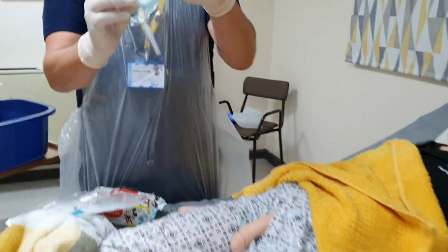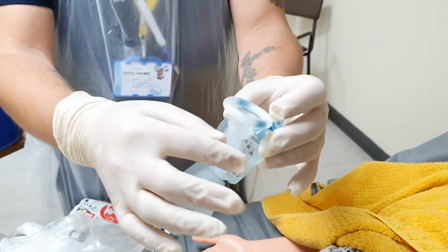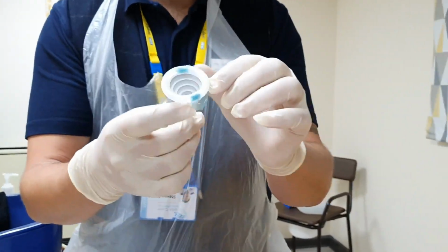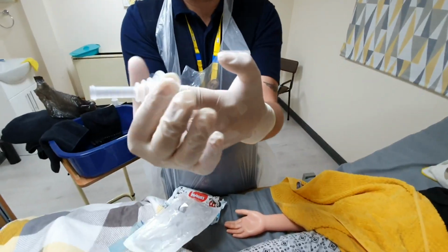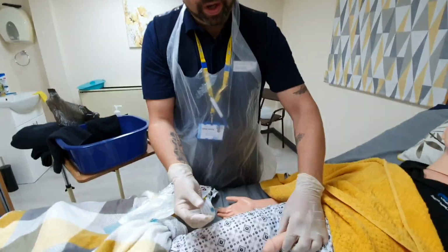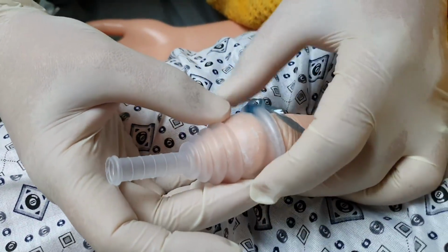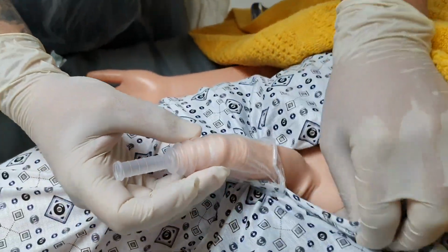We're going to open up the convene first. Okay. And it looks a bit like a condom with a filter. Okay, and you've got your blue strap. Now, the idea is, like a condom, it's going to go onto the penis and we're going to pull down using this and it'll roll down. So the tube is on the upside. So we need to pick the penis up and we need to hold the top and roll. We use the blue pull and it pulls down.